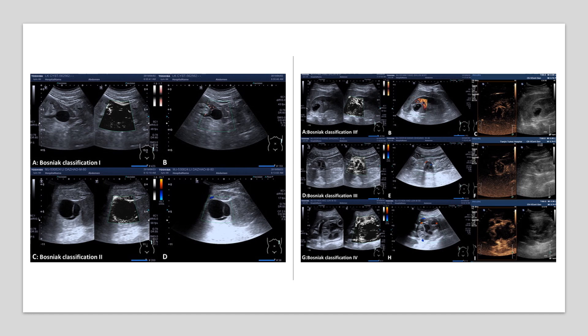On this slide, you can see examples of what a Bosniac 1, Bosniac 2, Bosniac 2F, Bosniac 3, and Bosniac 4 cyst look like on ultrasound.